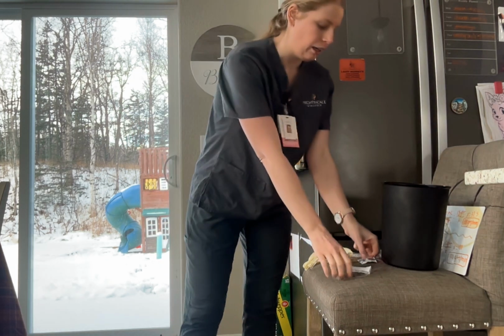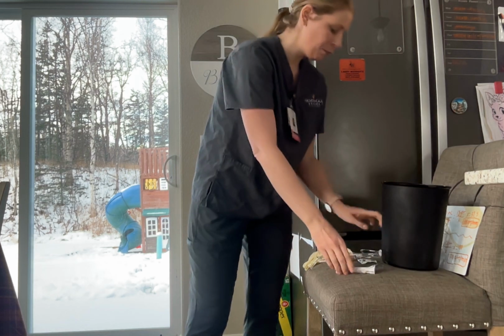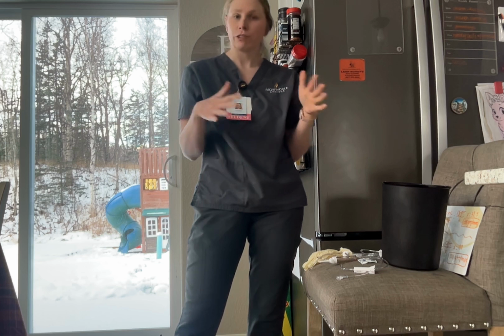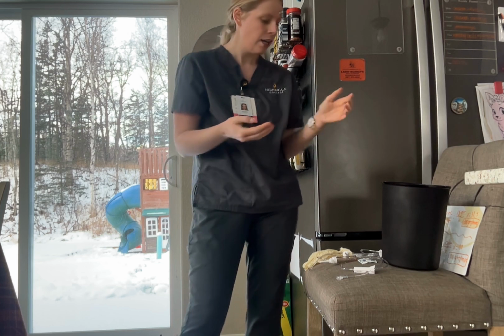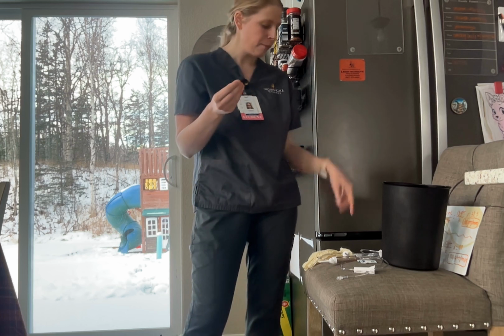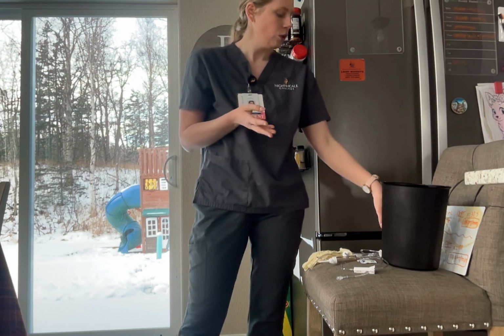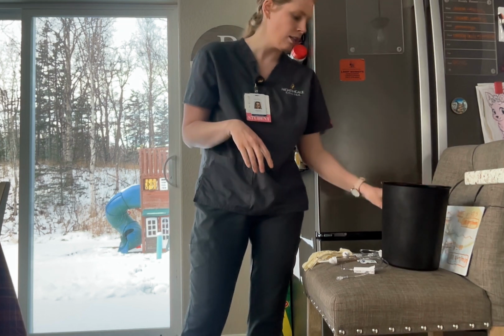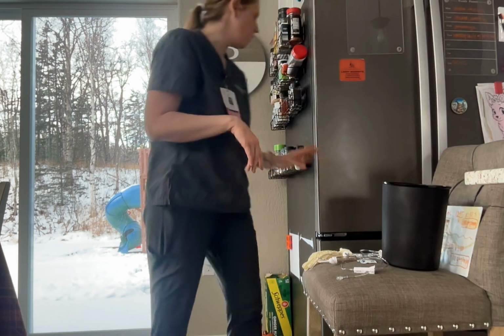Here we have our secondary tubing, primary tubing. These have been opened just for practice. However, in a real situation, you would not use opened ones. We have our alcohol prep pad for cleaning the secondary tubing, gloves, our normal saline, and our amoxicillin, as well as our calculations. And this is our sink, and this is our IV pole here.